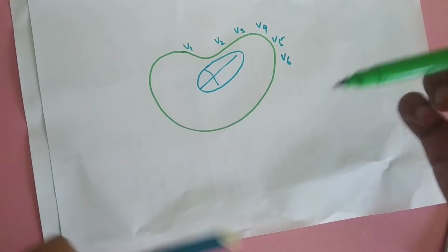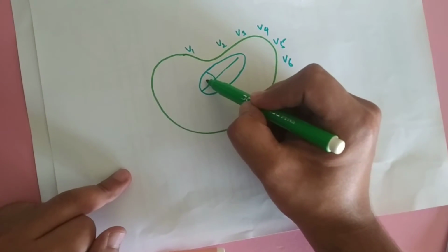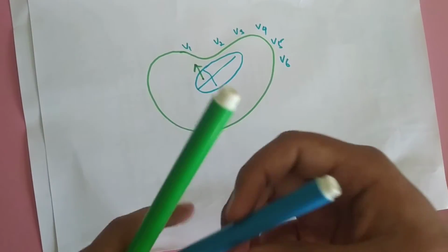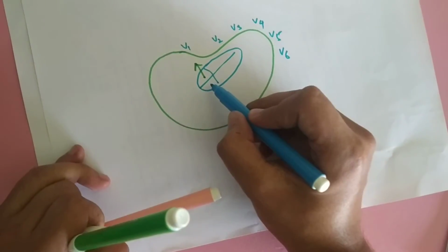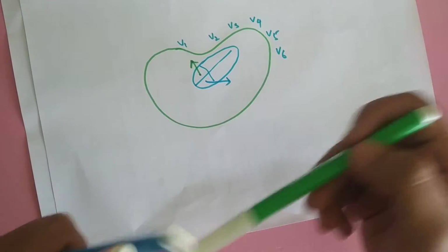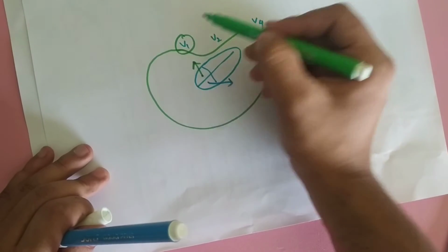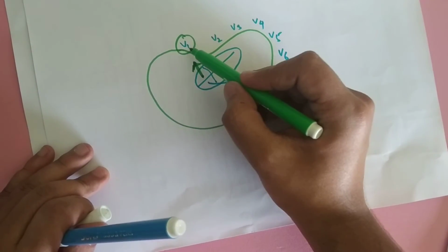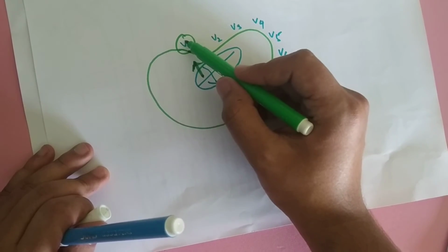So this is your right atrium. The right atrial vector will go in this direction, whereas your left atrial depolarization vector will go in this direction. So you see this is the direction of V1. When the right atrium depolarizes, it is picked up positively by lead V1.